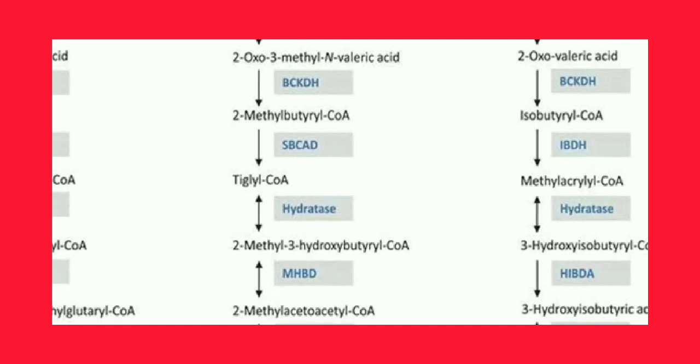These four analytes you see in black color are detected in GCMS, that is urine organic acids. These are organic acids, very small molecules, which we detect in GCMS in a urine sample. This is semi-quantitative, right? Based on the presence of these analytes, you can say it is isovaleryl glycine, or you can say it is 2-methylcrotonyl glycine.